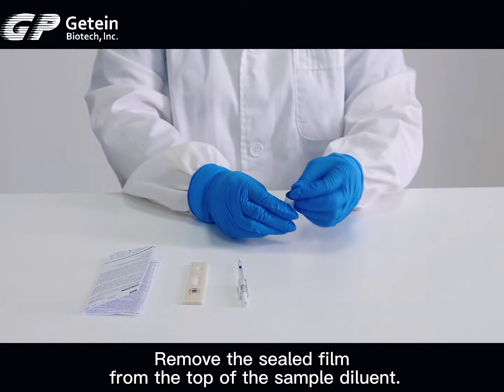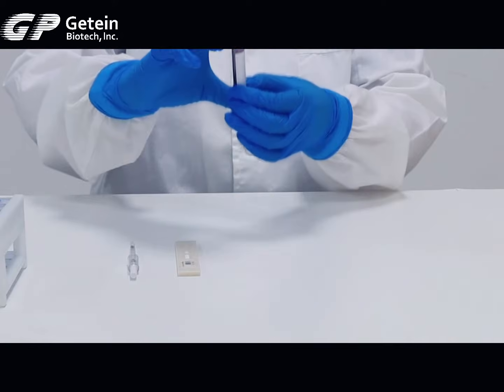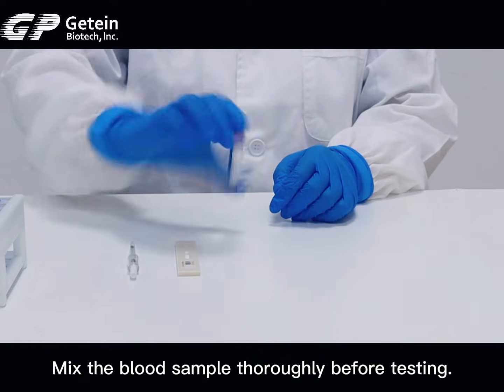Remove the sealed film from the top of the sample diluent. Mix the blood sample thoroughly before testing.